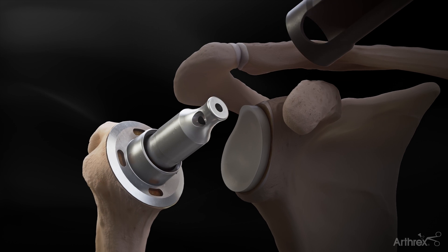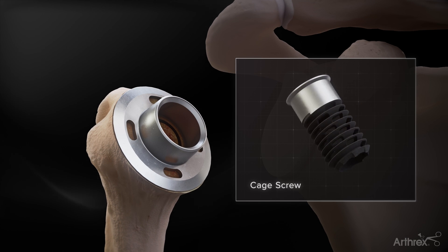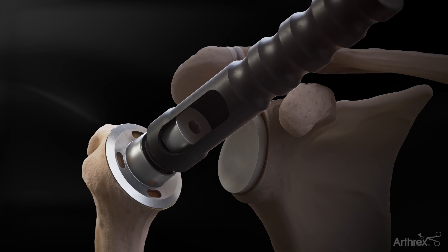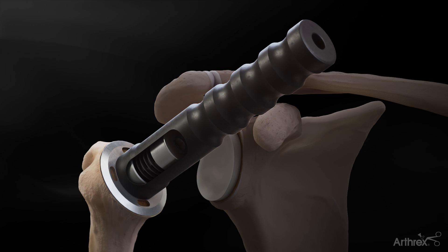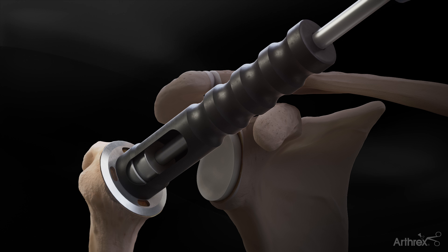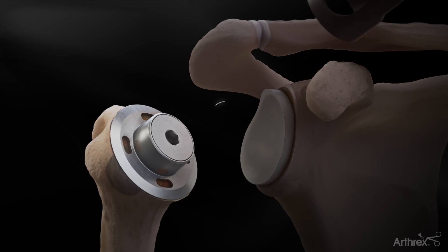Remove the trunnion impactor and centering device and place the cage screw into the center of the trunnion. Using the trunnion impactor, put pressure on the trunnion to hold it tightly against the resected surface and advance the cage screw using the screwdriver. Once the cage screw is fully seated, remove the trunnion impactor and screwdriver.